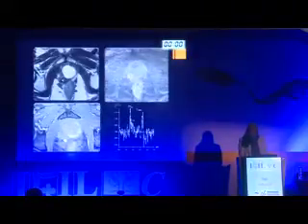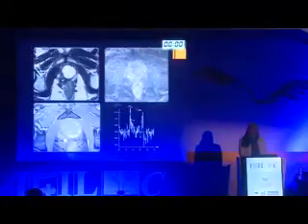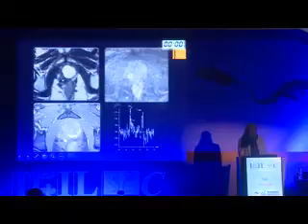We can see the same lesion that was noticed and missed on the previous CT, and we can see it here, but we can't discriminate if this is an actual recurrent lesion or fibrotic changes. The functional data proved that this was a true recurrence, with the pronounced diffusion restriction noted here, and also the remarkably elevated choline peaks.